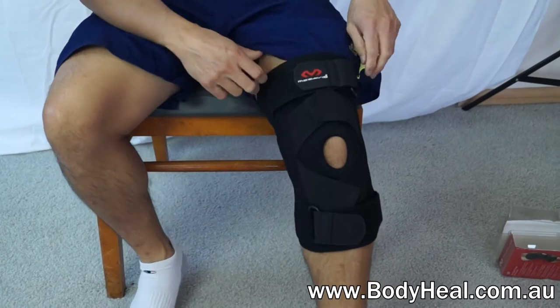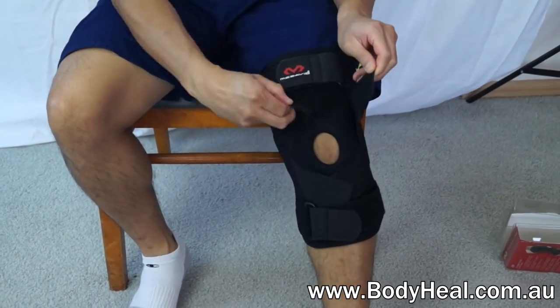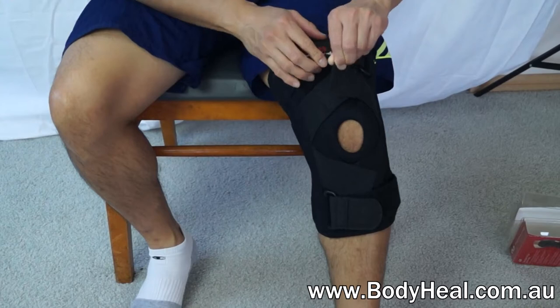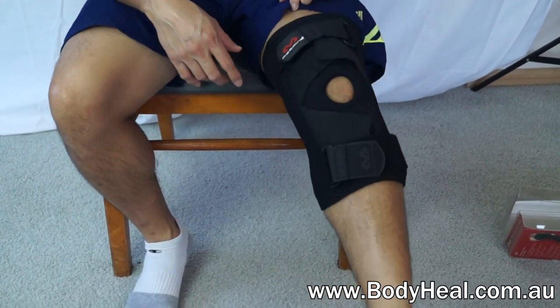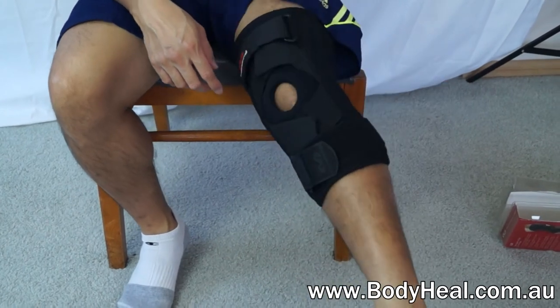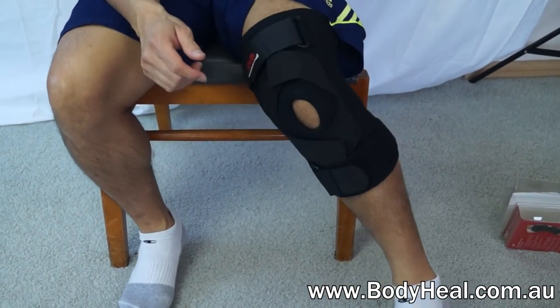It's great for weak or damaged knees and can be worn during sports and other activities. The four elastic crossing straps add ligament support and a padded buttress supports the patella. It's available now from BodyHeal.com.au.